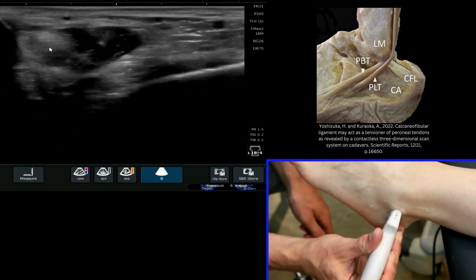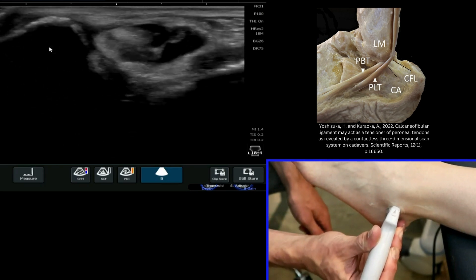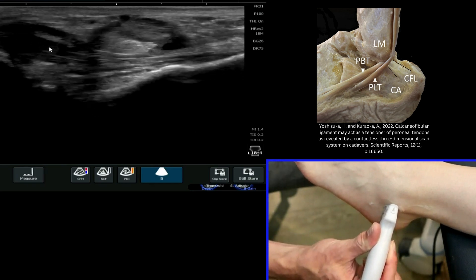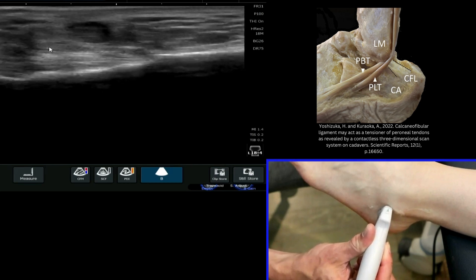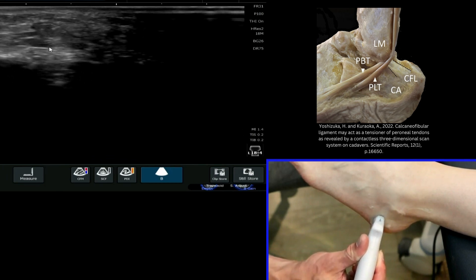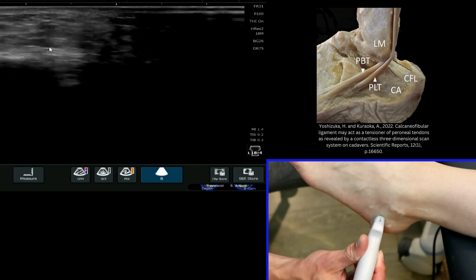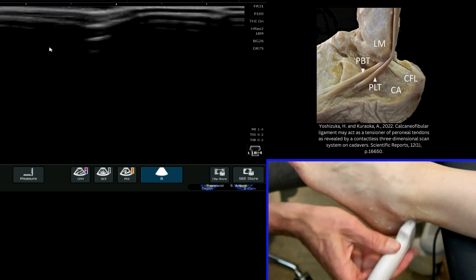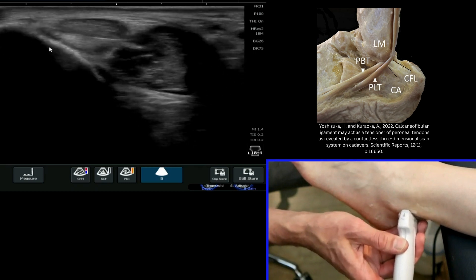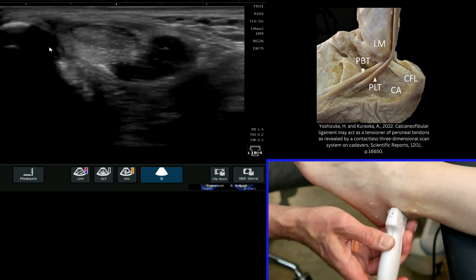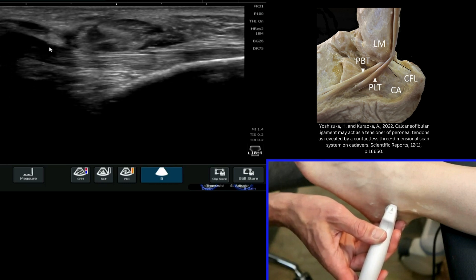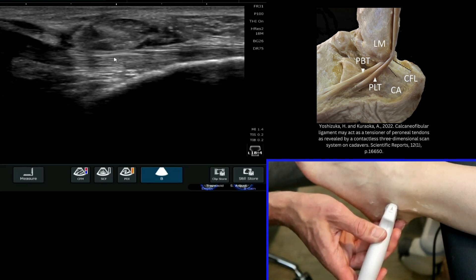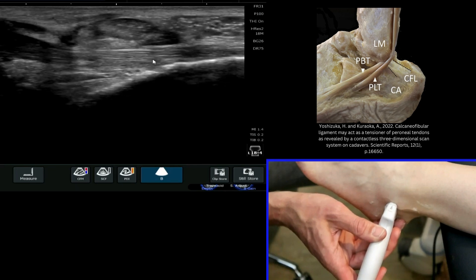Going back to the landmark — you can see that if I get onto the CFL, it's almost directly in a line straight down towards the apex of the heel. That's a useful surface marking for that ligament. The peroneal tendons run down around the corner, and there you should find your CFL underneath them, if it's intact.